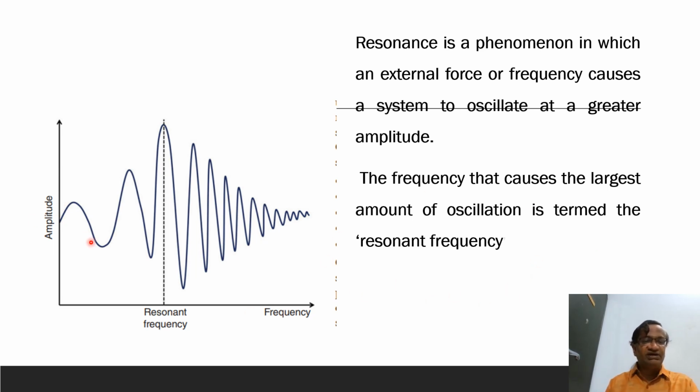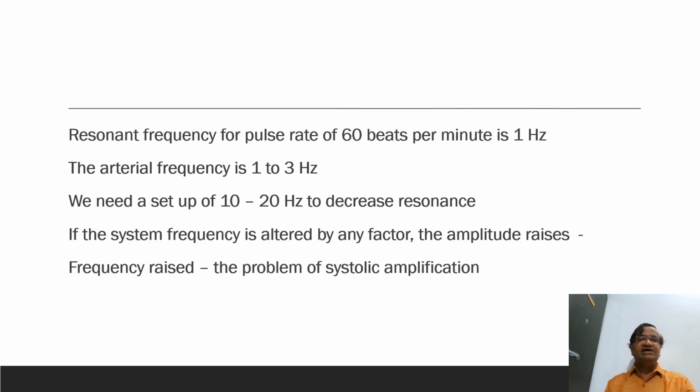Now this is going like this. If you give an external frequency to it, and the external frequency is the same as that, then the amplitude rises to the maximum. That is called the resonant frequency. Understand? Or I will come back again.